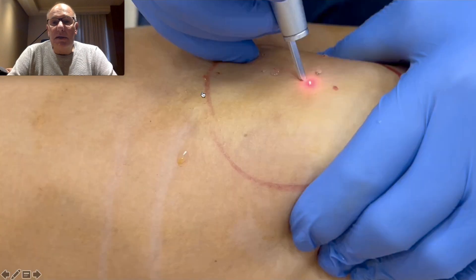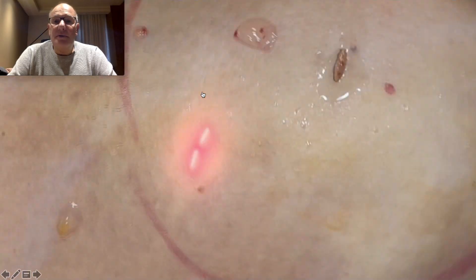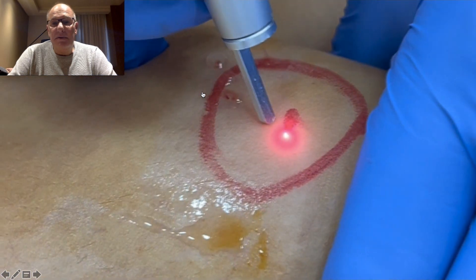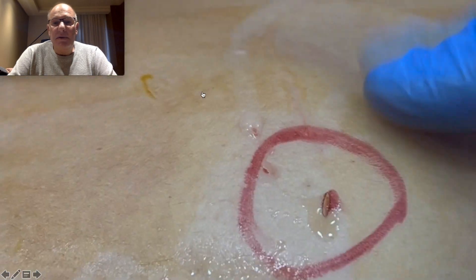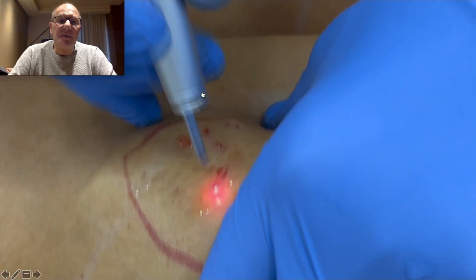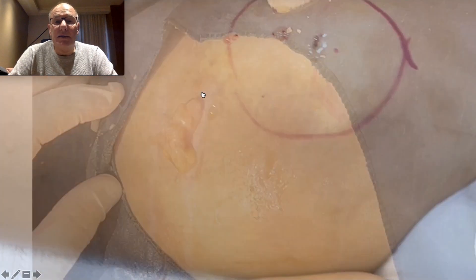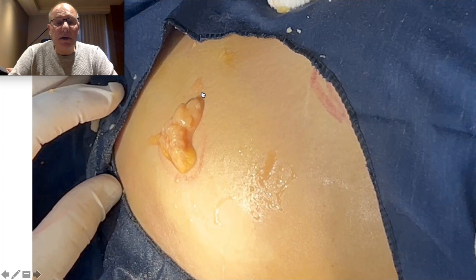Here you can see the way that I cut the skin. This procedure is performed only under local anesthesia. There is no sedation. After I finish the procedure, the patient can go to visit our city or can fly again to their country. Here is the way I remove it endoscopically, with a special technique that I developed during 40 years.